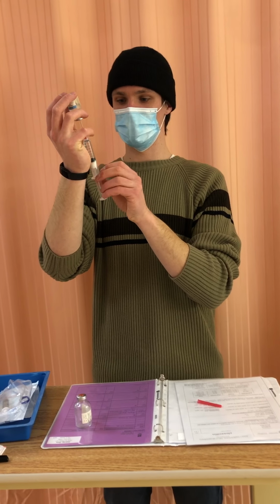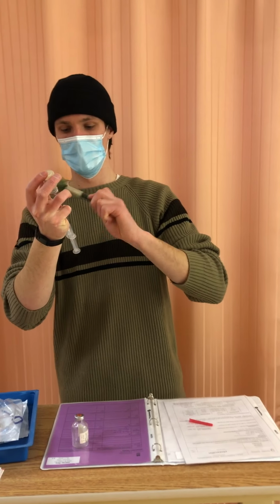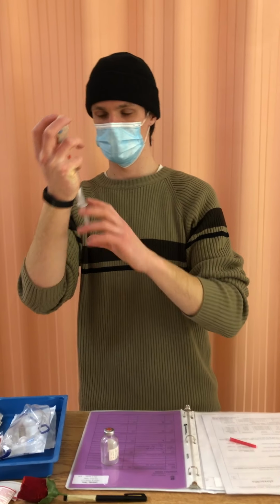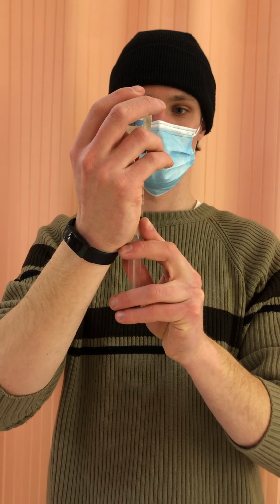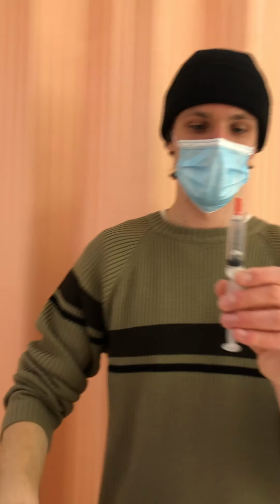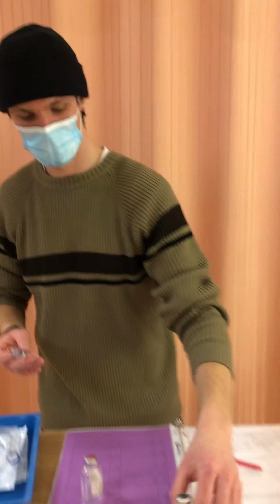And so I'll draw out 6.8 milliliters and tap out all the bubbles here. Perfect. So now I'm going to check the IV site. And recalibrate to 6.8. So I have 6.8 milliliters of sterile water here.